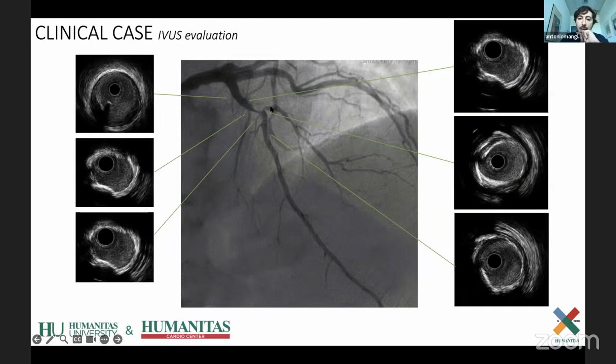You see some fibrosis. You can say something about the thickness of calcium in this case. So I don't see any calcium nodules. I see some fibrotic plaque, and basically that's it. I mean, it's very concentric plaque, with calcification of the wall.